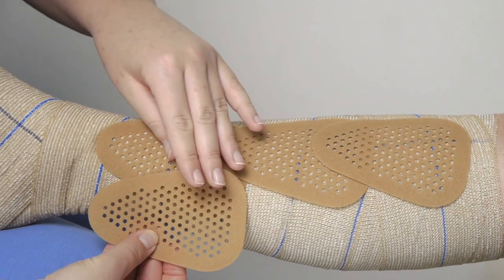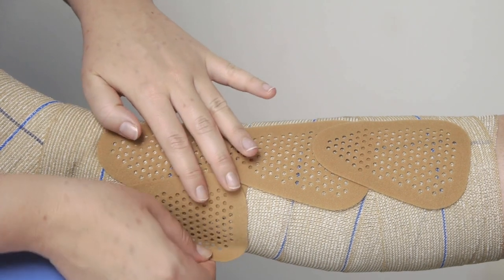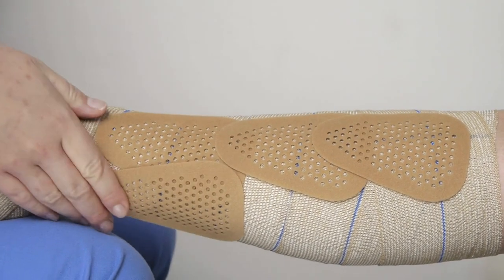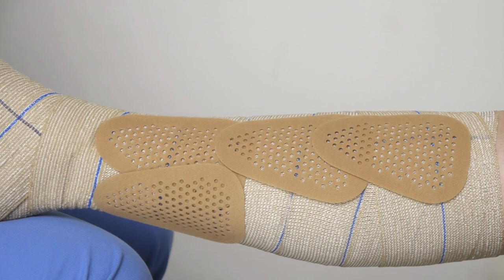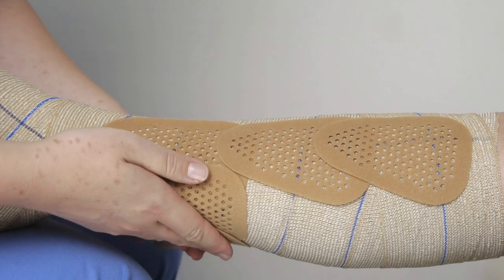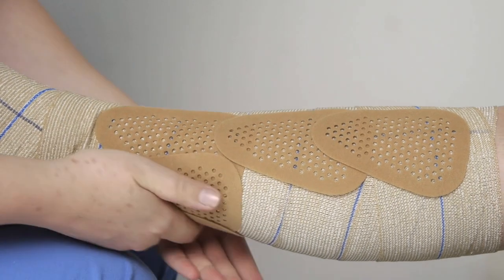Again, stretch them slightly during application to avoid any air pockets between patch and bandage. Press patch and fix patch add stiffness to the bandage, providing the increased working pressure.